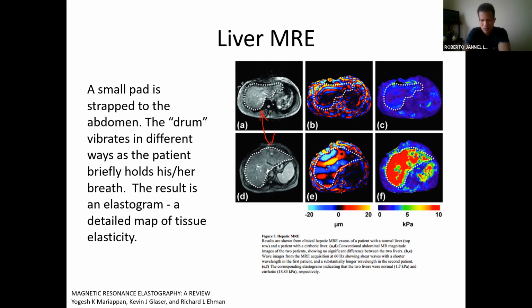But for the untrained eye, you can also argue that it looks kind of brighter at the top, but I really cannot see much more than that. But if you look at the elastograms here, it's day and night, right? So that thing that engineers would love to do with their phantoms is not completely removed from reality.